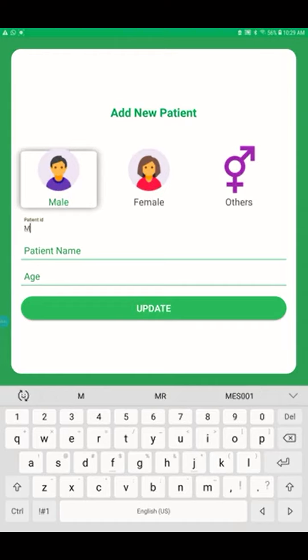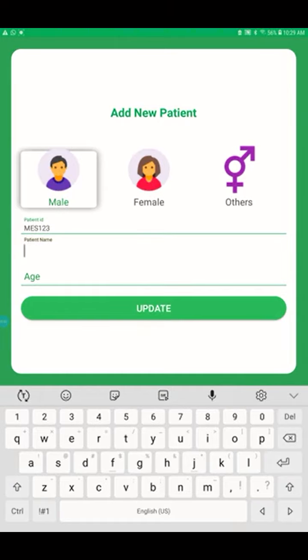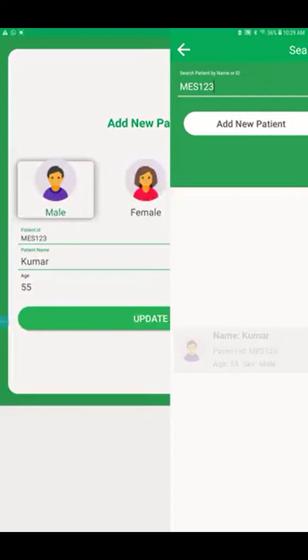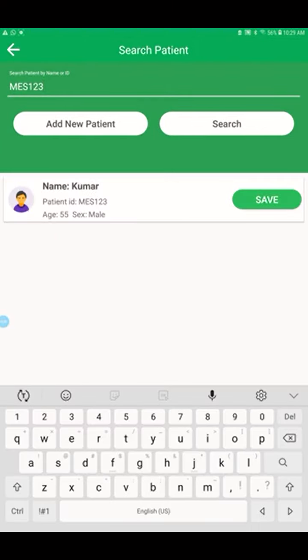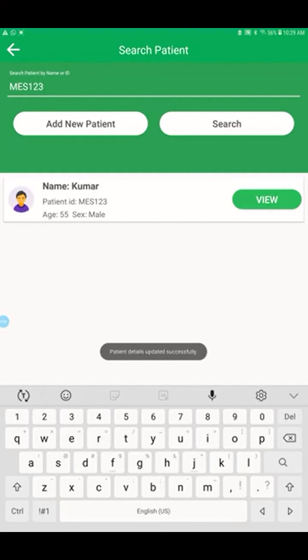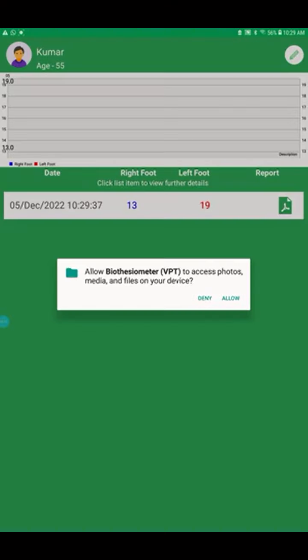Like now I am doing it, MES 123. Okay, then patient name and age. Okay, and then updating it. The patient name is already seen here, so I just say save. It will ask for permission, and now it says updated successfully, and then it asks for view. You select view. Okay, again it asks for permission.